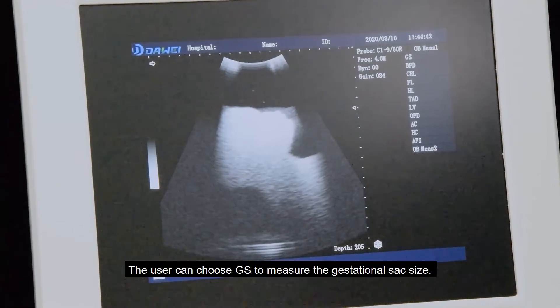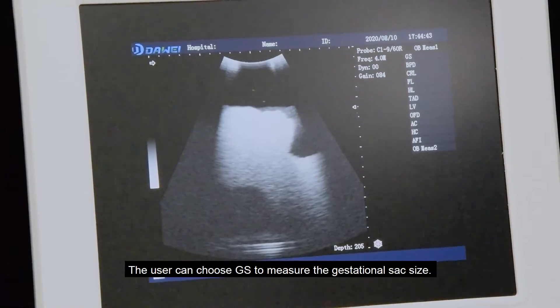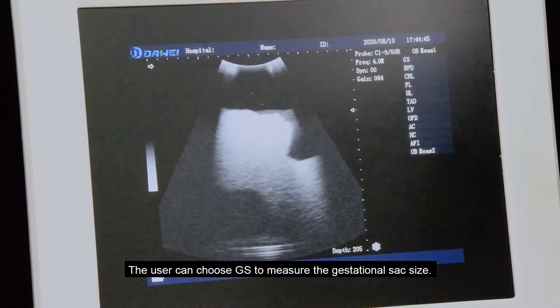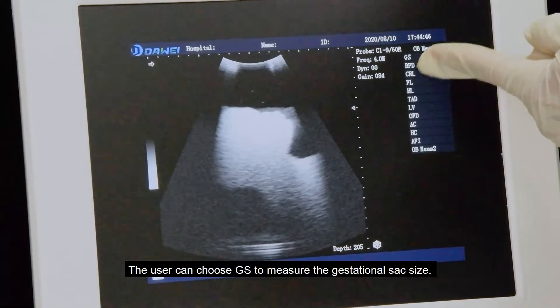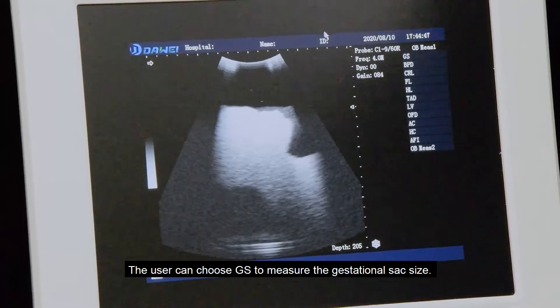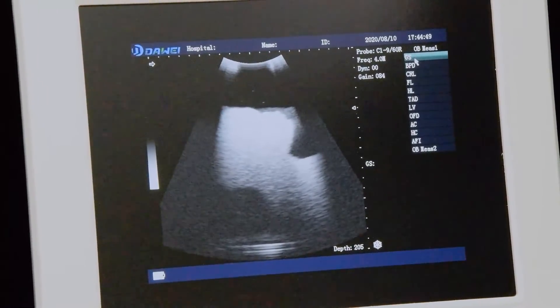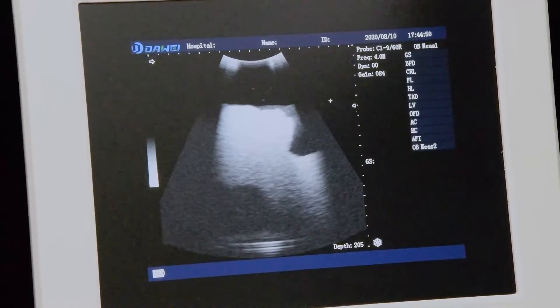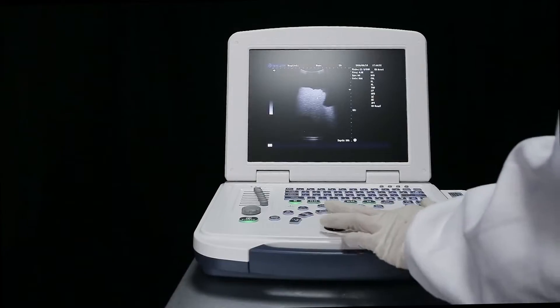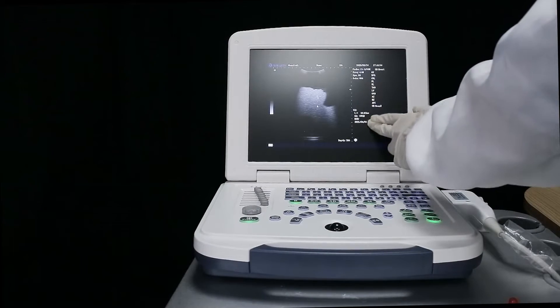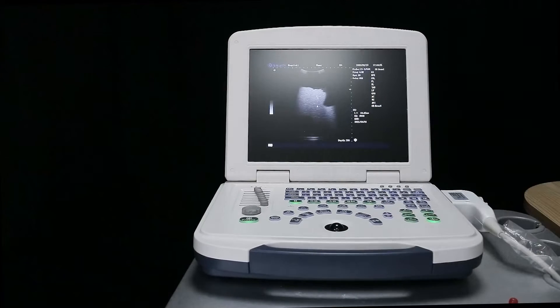The user can choose GS to measure the gestational sac size, and the procedure is completed.